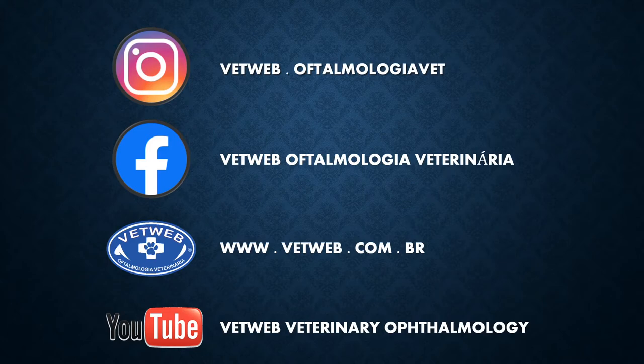So just answering one question here by Pewish Dubey. We're gonna do phacoemulsification, okay? We do not use the extracapsular or intracapsular extraction anymore, for a long time, because phacoemulsification has far better results.